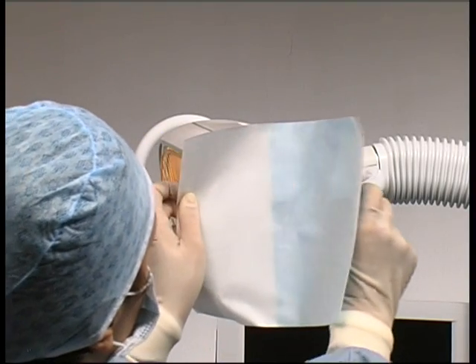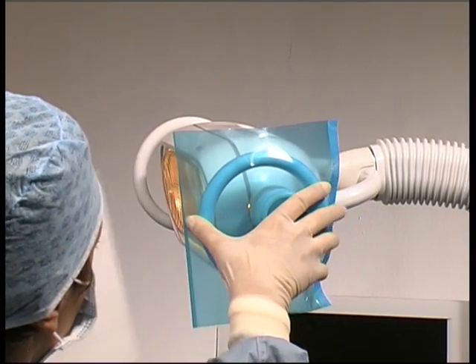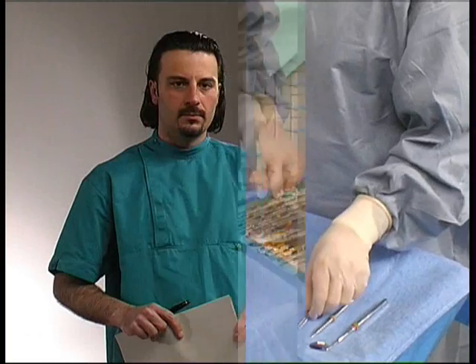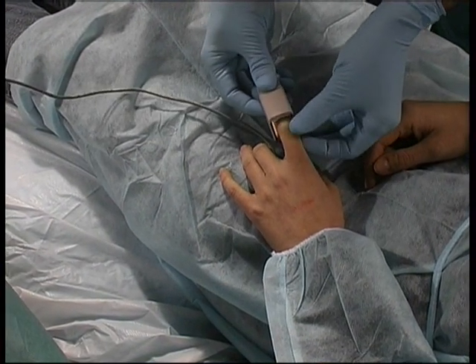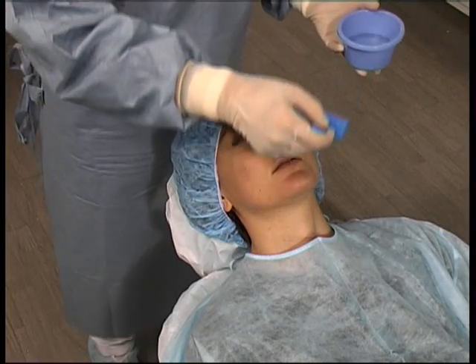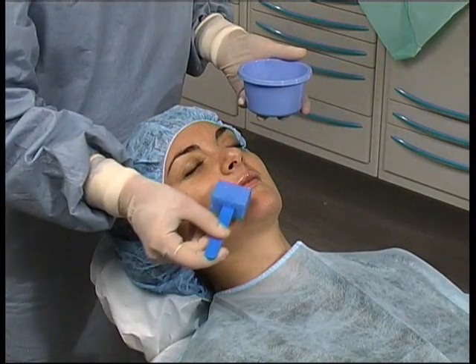The lamp handles are isolated using special adhesive covers. Finally, the instruments needed for the operation are laid out. We can now proceed with the preparation of the patient. The aim must be to isolate the operating field from potential external contamination. The patient is hooked up to a pulse oximeter that monitors the parameters during the operation. Using the special kit, the assistant disinfects the skin around the oral cavity, starting from the lips and moving outwards.